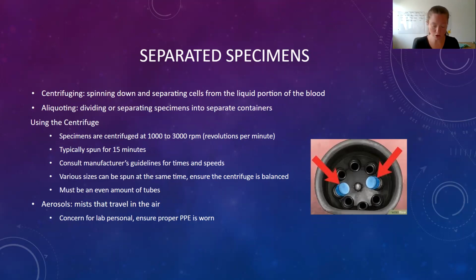We have to make sure that all tubes are properly labeled, because listen, if I have my labeled specimen that is in the lab now, and a portion of that is being transferred to another tube for further testing, what do I need to do to that second tube before I can move the blood or whatever portion I'm moving? It needs to be properly labeled. Super important. So make sure you have labeled specimen containers accurately before doing any kind of aliquoting.